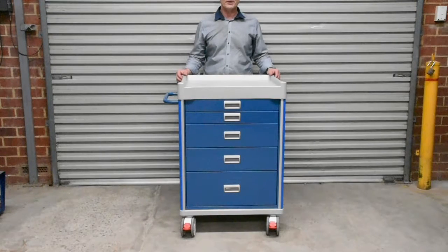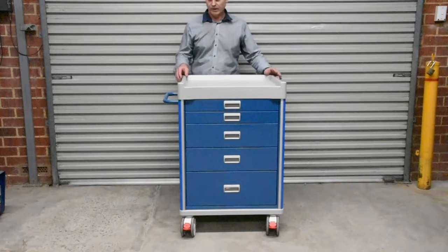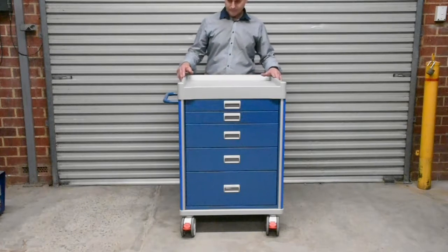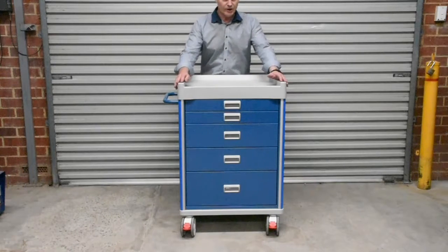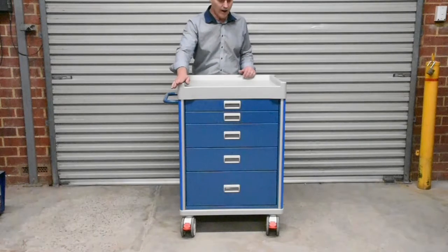Hi, I'm Chris from Surgical and Medical Supplies. I'm going to go through this Viva Aesthetic cart with you. This is one of about five different configurations. They vary with the number of drawers and drawer heights. These are 69 centimetres wide, 50 centimetres deep and 101 centimetres high.